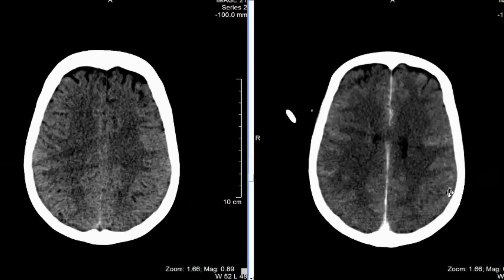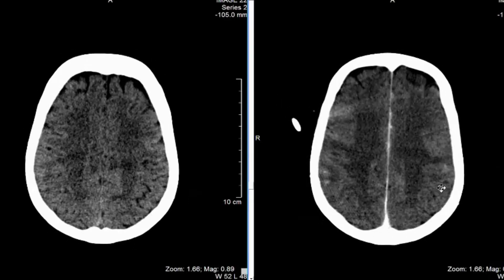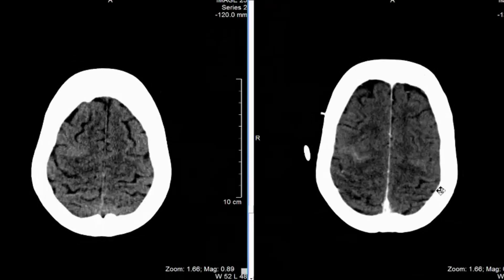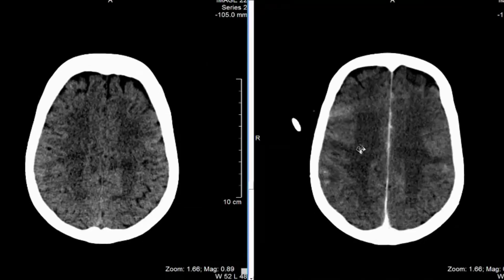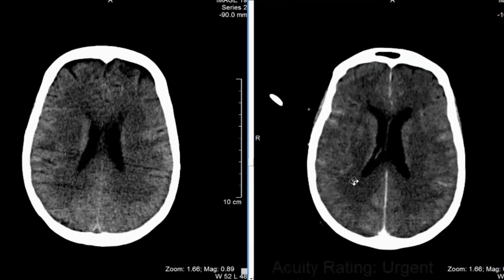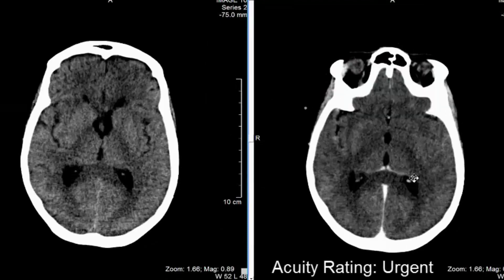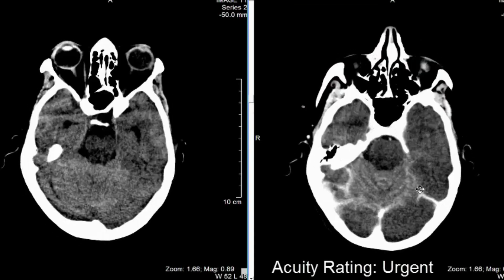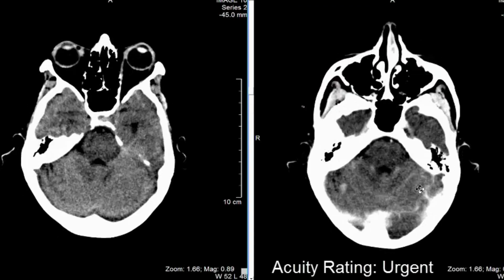So what this could be is carcinomatosis — given the history of breast cancer — or meningitis. It's all leptomeningeal enhancement extending all the way along into the deep sulci. Given the history of altered mental status and breast cancer, and no history of fever, the most likely diagnosis is leptomeningeal carcinomatosis.